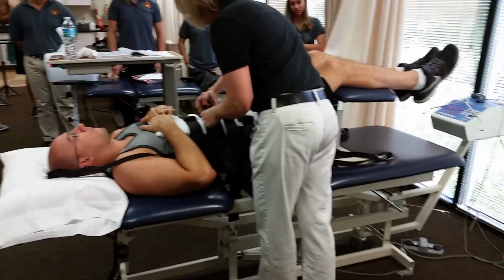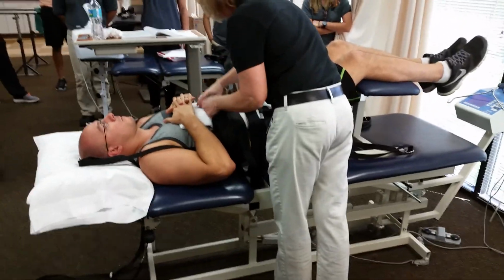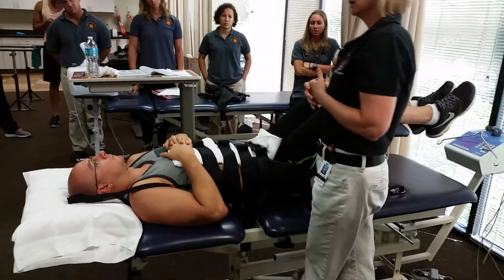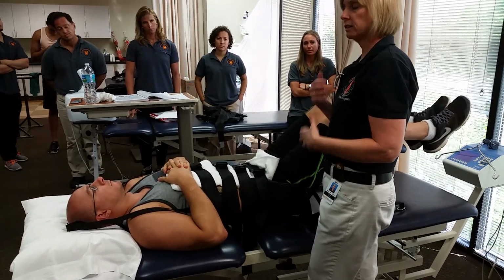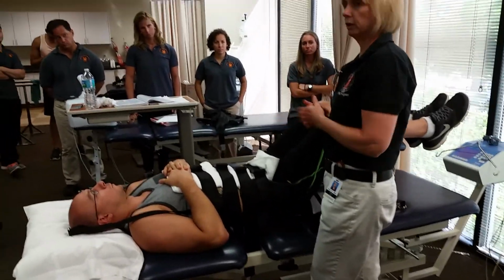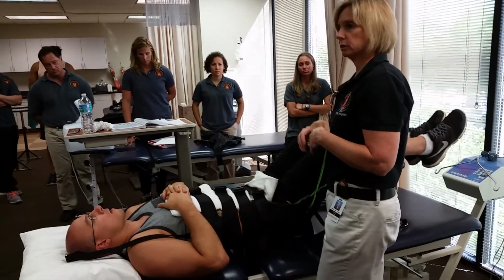Now, some patients prefer to leave the belt on while they sit up so that they're still getting that compression and it feels good. I'm always a little concerned about passing out, so I like to undo the belts lying down. It doesn't really matter. It depends on the therapist that you're going to be working with and your experiences.